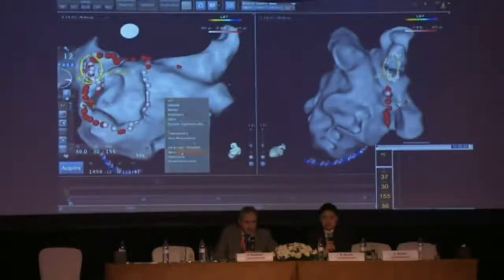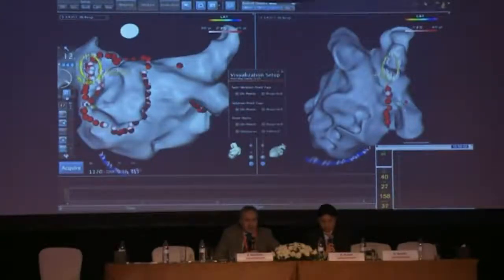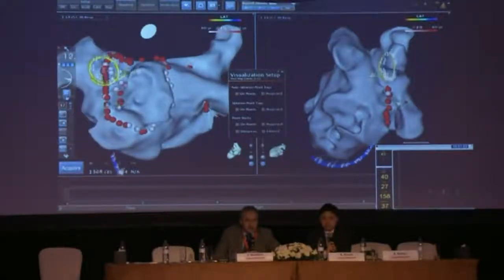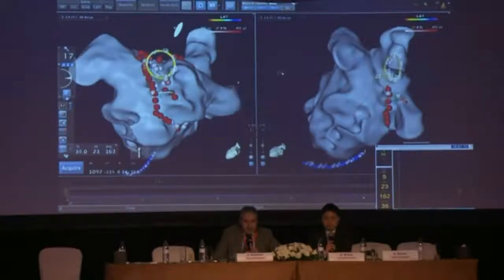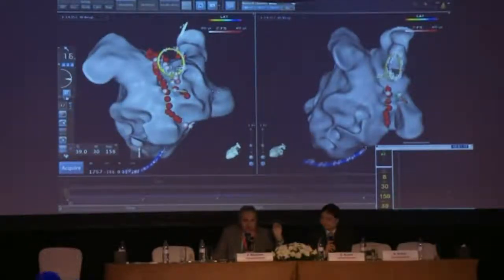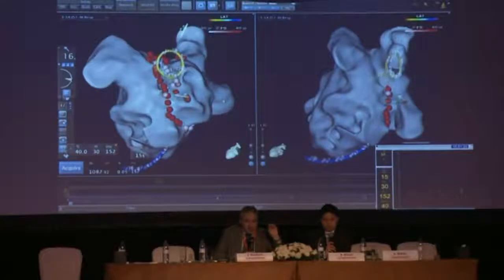Yeah. I could show you them. Let's see if visualization is set up. So here you can see where I've added lesions manually just to pull the geometry in. Yeah. But I'm not looking at them. I'm not using them to really mark the lesions. It's the VisiTag that's telling me where I'm really doing the lesions. Sure. So this VisiTag is kind of smart tagging. Instead of having only some dots of the same size and same color, this has a meaning.